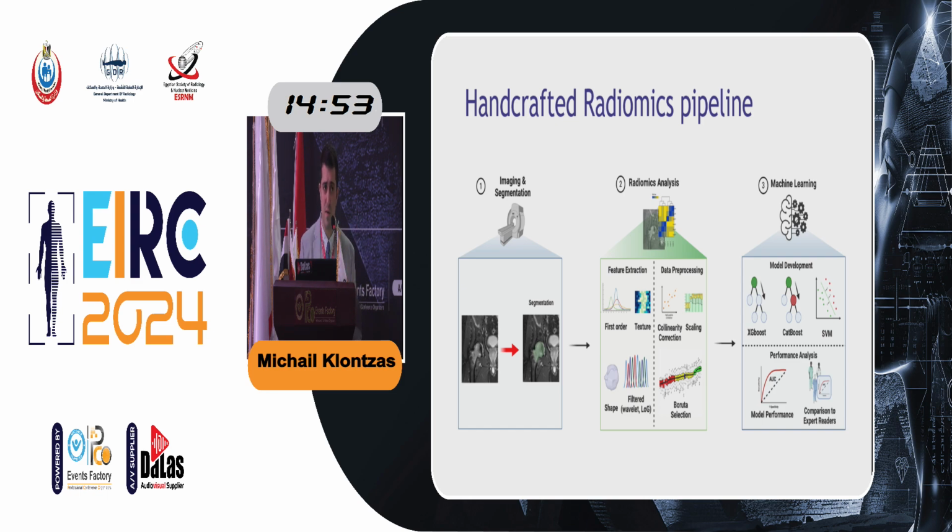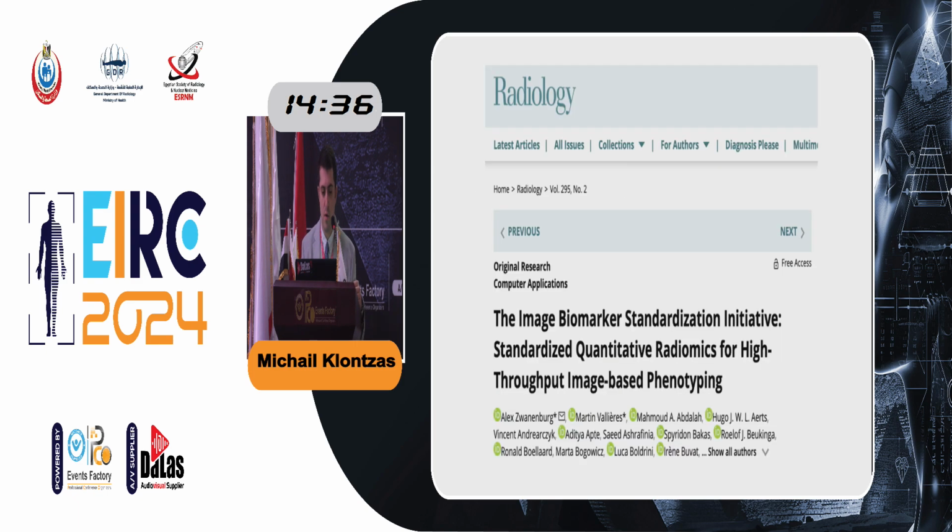That series of numbers is the radiomics features that we call handcrafted radiomics features, just because we have predefined a series of functions to derive those numbers. When we have that set of numbers, we can use it for machine learning, and we can do all sorts of things that you've seen in several papers in the literature at the moment.